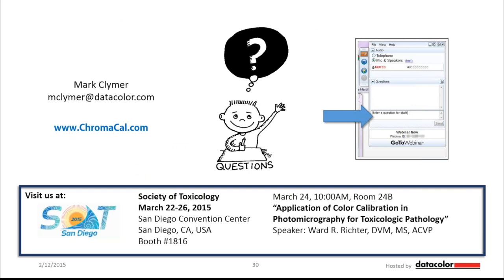There's a question about the sensor alignment, I think regarding the monitor calibration, and Dr. Hammond, I'll take that. What Dr. Hammond was illustrating is how you place that sensor in the software when you're calibrating your monitor, and it's very easy to do actually, and it'll just hang there against your monitor. There's a little template, a little shadow that you place the monitor on top of.